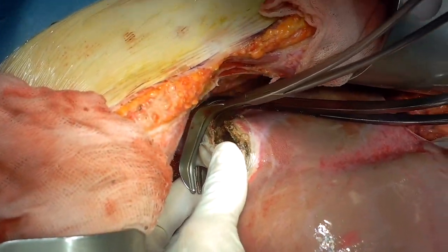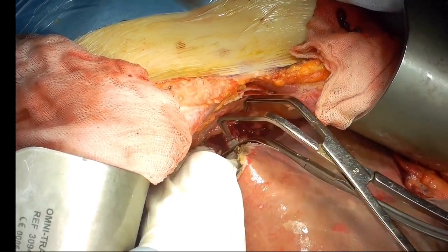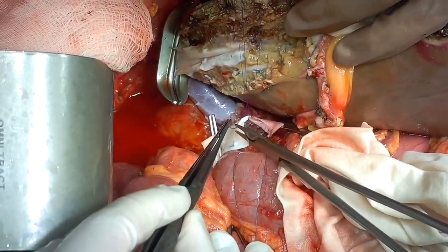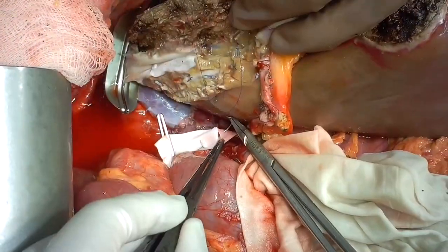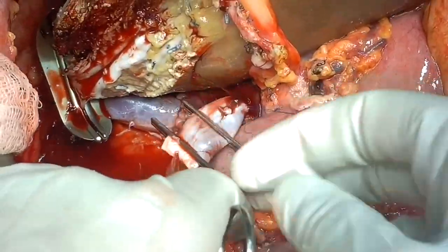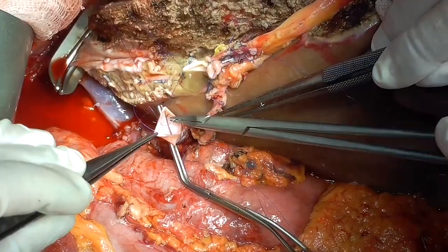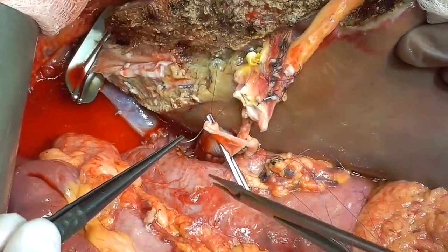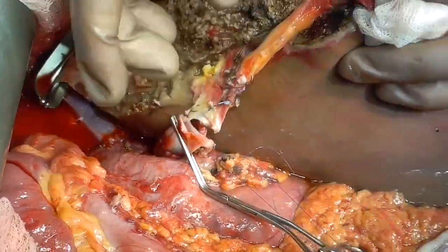Using a stapler, we divide the portacaval anastomosis. We then remove the clamps, restoring blood flow through the inferior vena cava. We then need to lengthen the portal vein and use a vascular cryopreserved graft for this purpose. After setting up the proximal anastomosis, we perform a distal one with the left portal vein of the liver remnant.